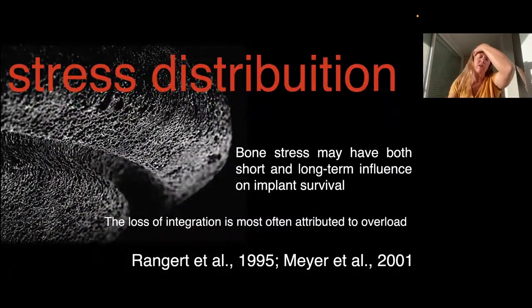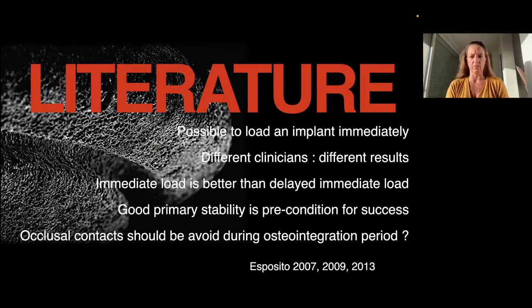When we rehabilitate our patients with bridges, it's also important to understand that the bone stress may have both short and long-term influence on implant survival. So it's always very important to check periodically the bridges, how the load is, and how the distribution of the occlusion is on your implants.